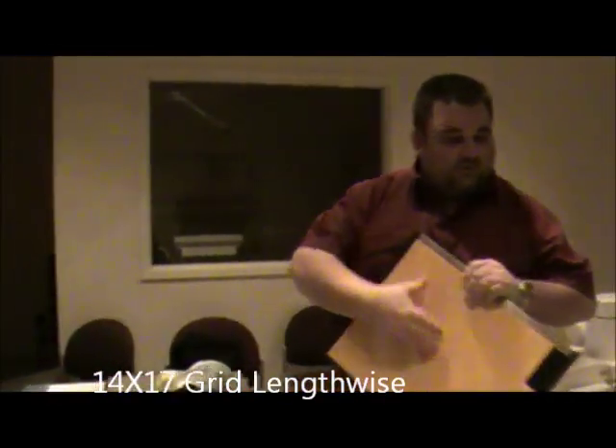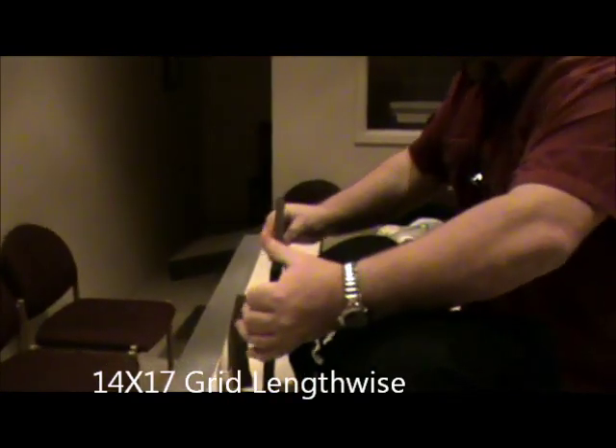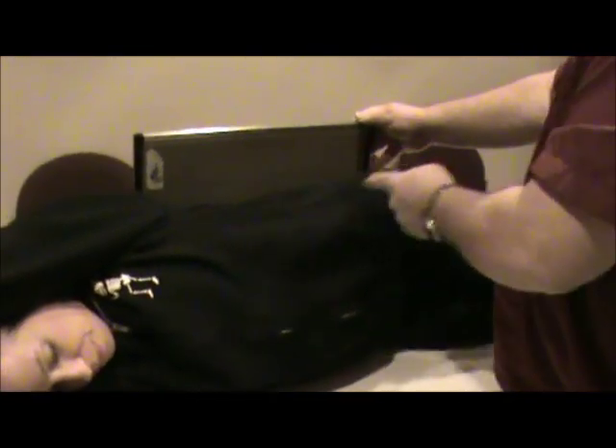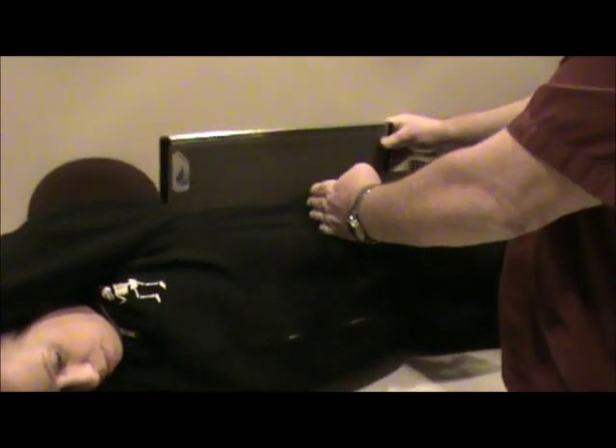The techniques are going to change a little when we get to the PA and other views. For a decubitus abdomen, this is going to be our first view. We're going to have the patient roll onto their right side. We'll use a 14 by 17, and this will be used as a grid. I'm going to palpate the crest. Since this is the right lateral decubitus, we're looking a lot at the left side, and because the splenic flexure is a little bit higher, I'm going to center about an inch or so above the crest.